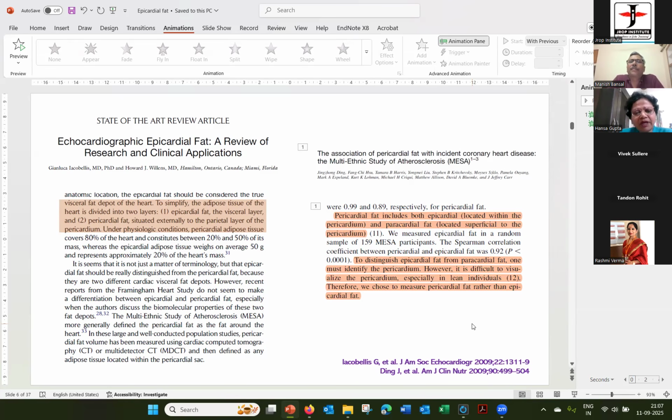Also, whenever you are thinking of something to do with the pericardial effusion, meaning excessively secreting pericardium, also look for pericardial thickness, and any history related to trauma, tuberculosis, or malignancy. And also the IVC.